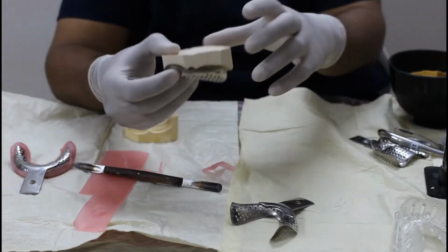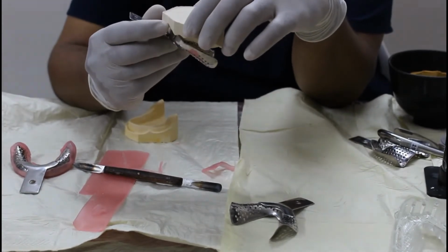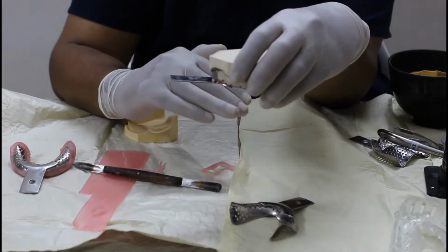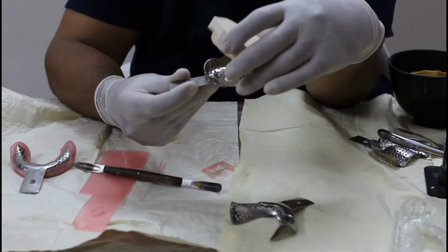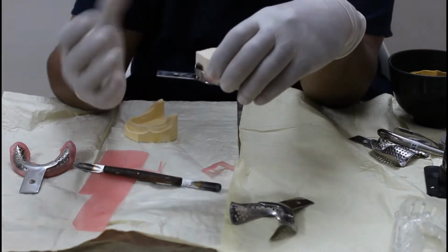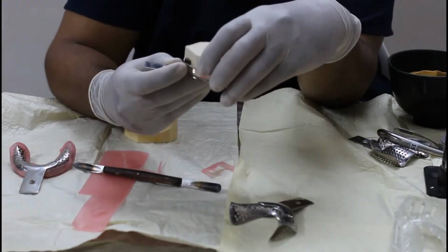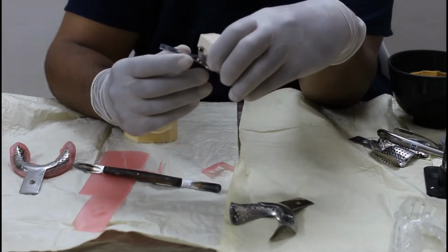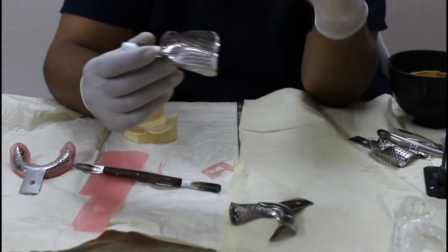Why do we do this? Imagine this is a patient. If we press the tray anteriorly first and then press it posteriorly, all the extra material will go into the patient's throat and then the patient will start coughing. So what we do, we place the tray posteriorly first in the mouth and then press it anteriorly. So all the excess material comes out labially and then we can remove that material. That way we can prevent coughing and gagging, which is one of the most common things which happens if your placement is wrong or if the material is excess.